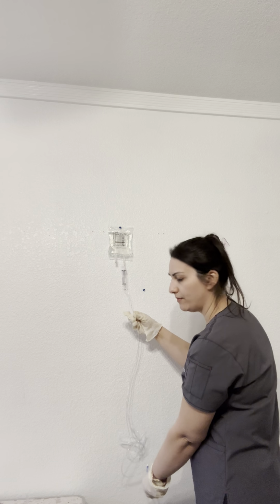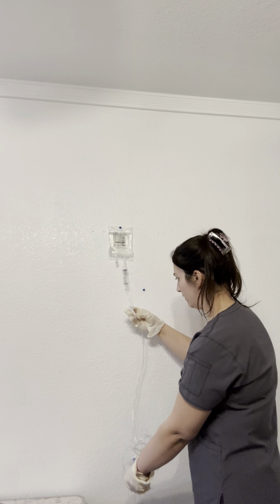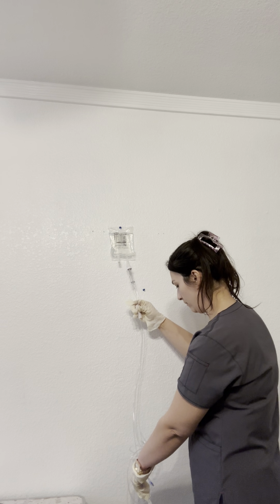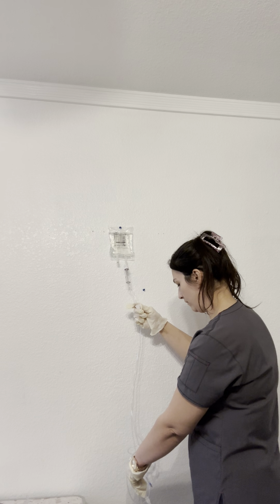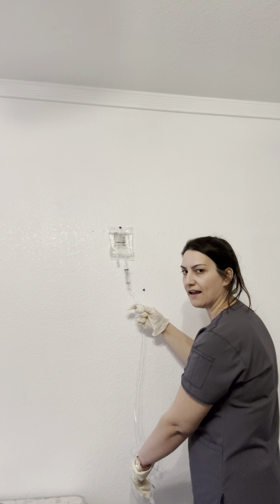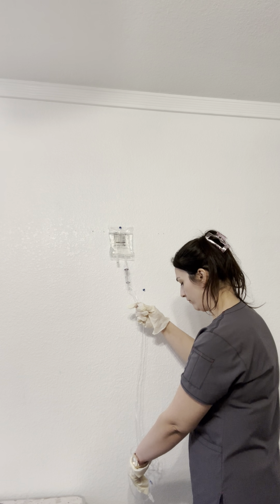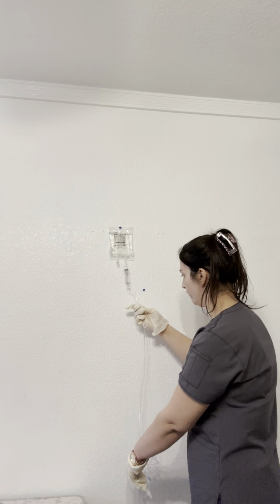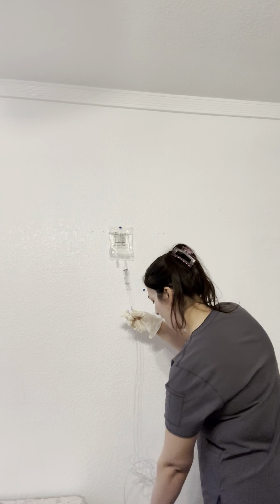A couple drops, so it'll be good, just to get the air out. We're going to clamp this, and we're going to go ahead.